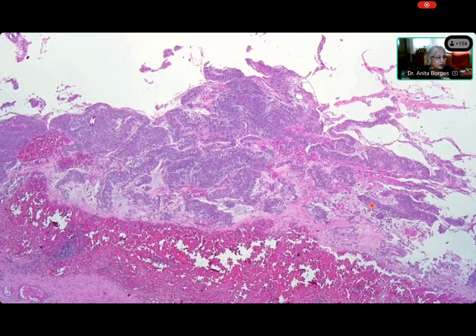You've got the history. Do you think it's a tumor or not a tumor? Yes, ma'am, tumor. Is it a cyst or not? Yes, ma'am. Cystic spaces are there on the top and solid at the base above the hemorrhagic area. All right. So, do you think that this tumor is solid or is it cystic? Ma'am, cystic with some solid areas. Okay. So, is it something like what you see in the ovary when you see a cystadenoma or a cystadenocarcinoma? Is it that kind of cystic change or what? Ma'am, solid with a cystic degeneration. Okay. Now we come to cystic degeneration.